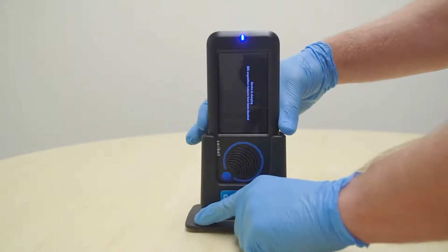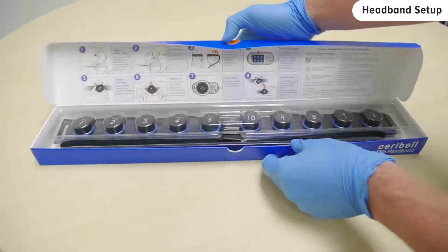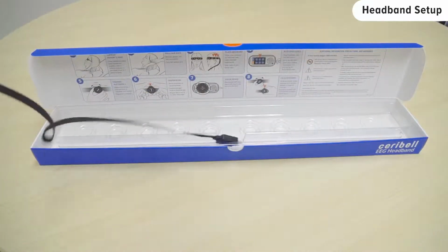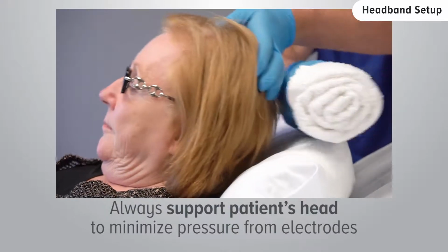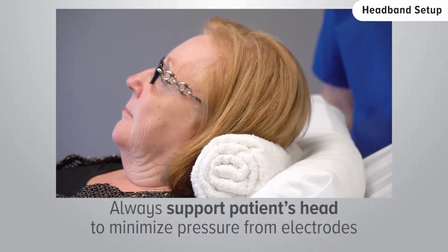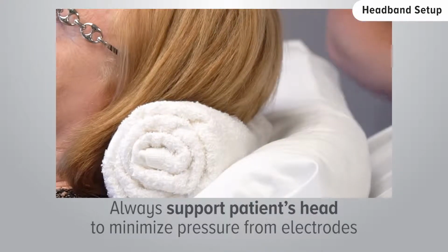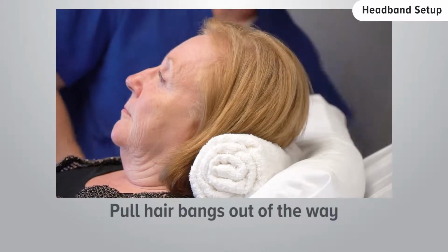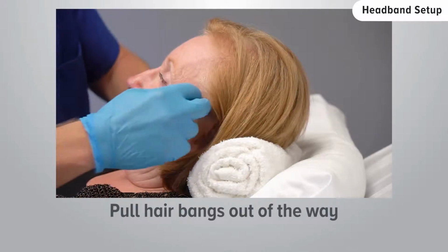Begin by retrieving the Cerebell recorder from the charging station and one headband. Support the patient's neck with 1 or 2 rolled towels to create a space between the back of the head and the pillow. This will minimize the pressure from the headband electrodes. Remove any glasses or hair accessories and tuck long hair behind the patient's ears.